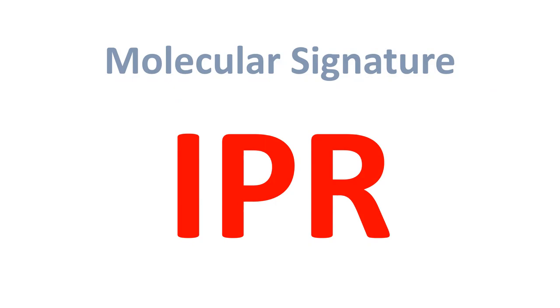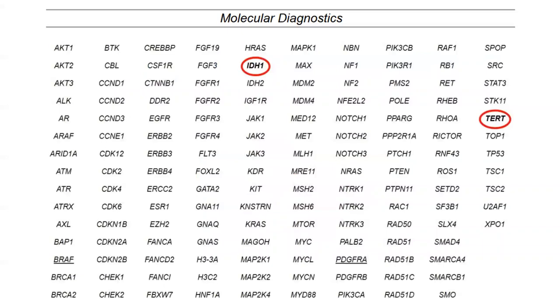And there's no tricks here. This is going to be a primary brain tumor. It's not going to be a melanoma or a metastatic course or something like that, right? Everybody understand? Okay, ready to play? Let's do it. What's a diagnosis? I've got all day.